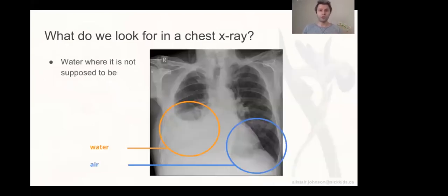Alternatively, of course, you're also looking at the lungs. You're looking for what you want to see in a good pair of lungs, right? Nice, full of air. So if you see some kind of water pooling at the bottom, especially, then that's clearly something that you want to understand why that's happening, and maybe figure out if you can help the individual to overcome this illness.